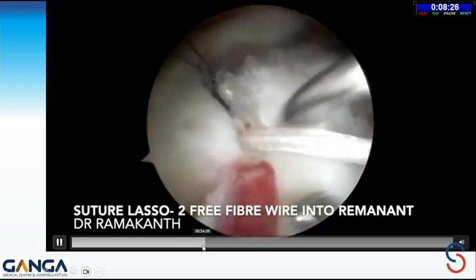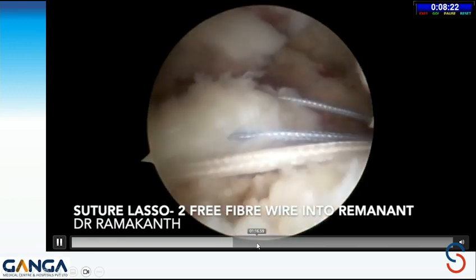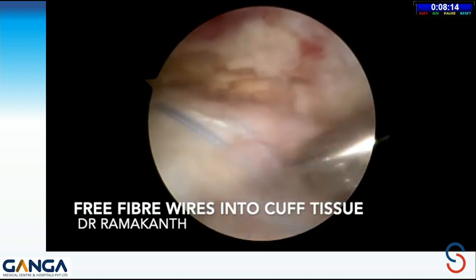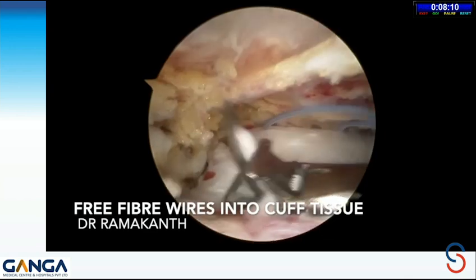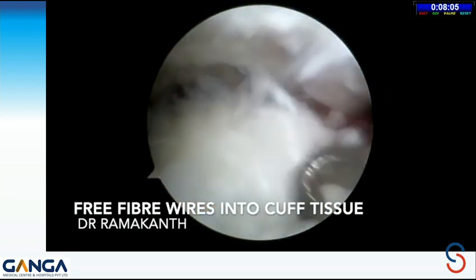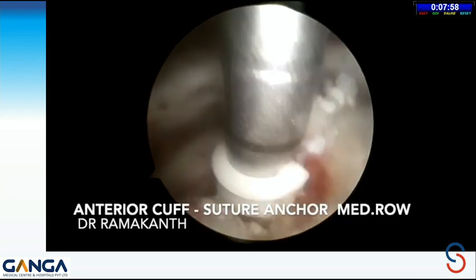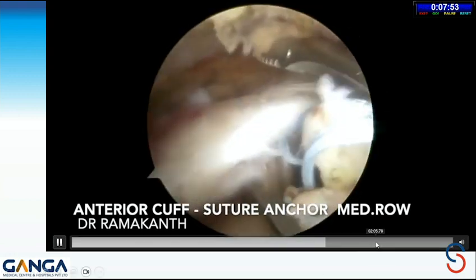These fiber wires were taken into the medial stump without tying the knots, because we need to have a good approximation and there should not be any tight repair which may strangulate the delaminated portion, and then we might lose it, which may be a possibility for the retear.